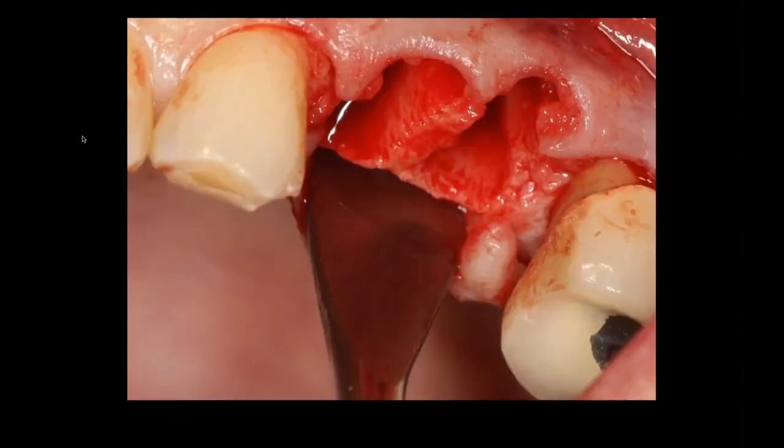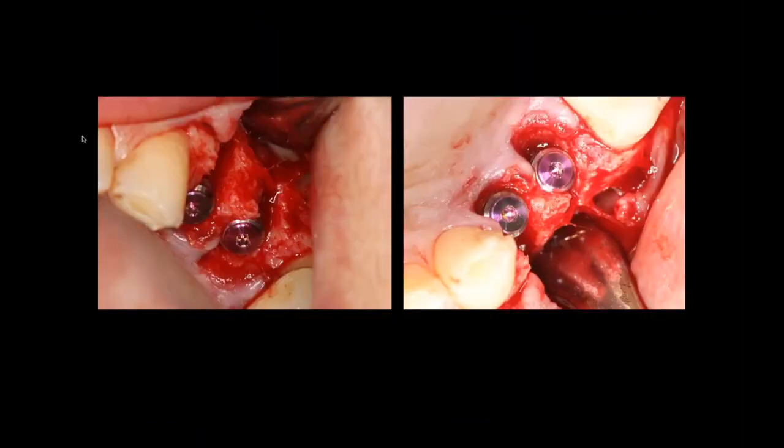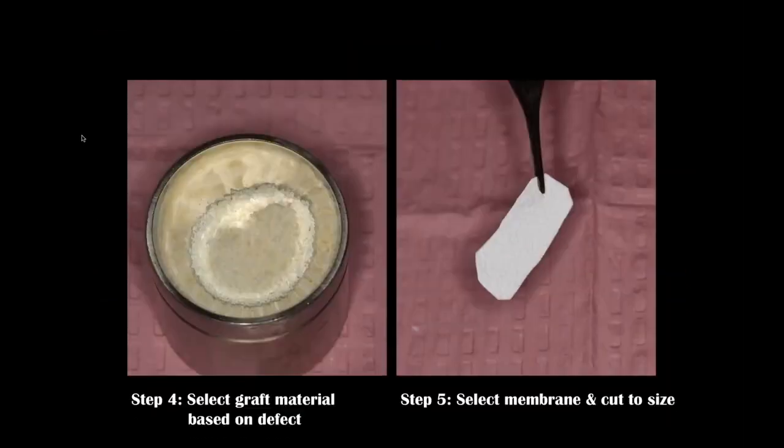I went ahead and placed two implants, and you can certainly see that we have a defect — the facial threads are completely exposed in this area. I do have initial stability, and here I'm taking my Goldent allograft material.